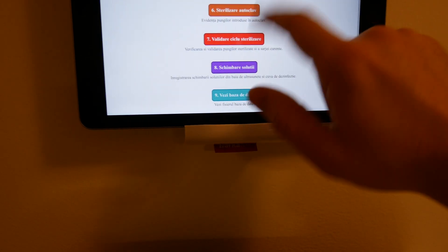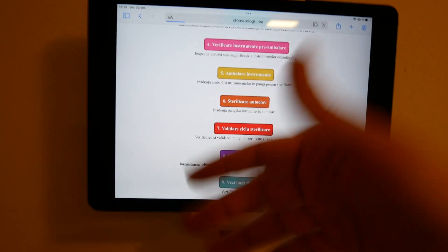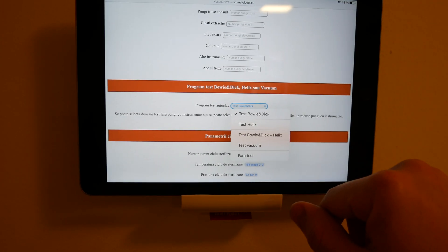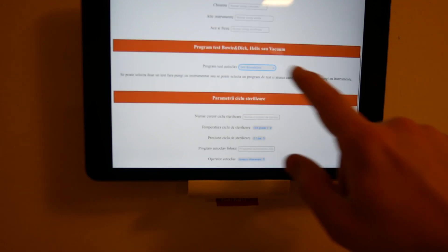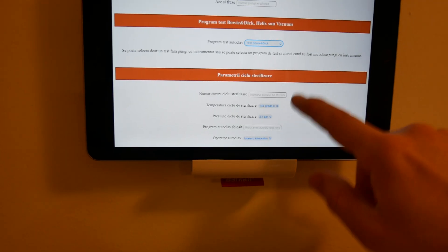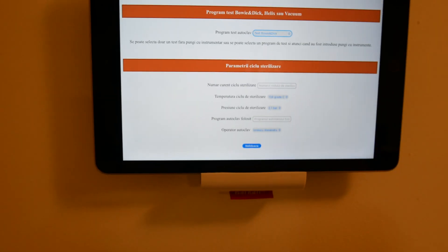And then I do my sterilization cycle. I also log the sterilization cycle, whether or not I'm using some sort of test program, Bowie-Dick, helix, whatever, and the parameters of the sterilization cycle.